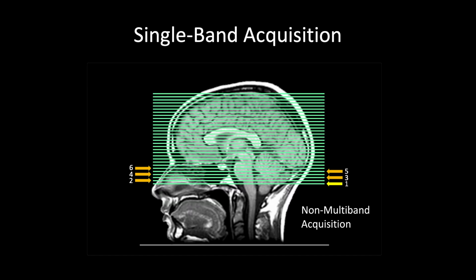So you've heard about this, I think, in one of the first lectures at the beginning of the course, but as I mentioned, the HCP recommends what we call multiband acquisition. Now, many of you who've done imaging up till now are probably pretty familiar with the single band acquisition. That's historically the way that we've gone about our data collection. And the idea is simply that we collect one slice at a time. We typically do an ascending interleaved, which means that we collect the odd number slices first, and then we collect the even number slices afterward.